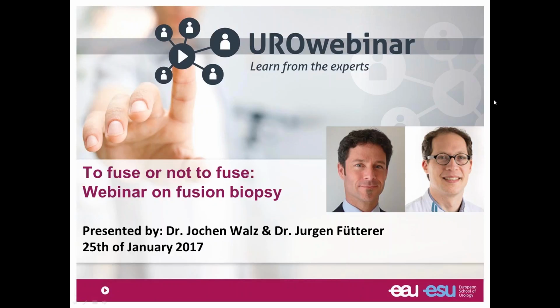There's another question coming up that is addressed to me. Do you defend doing MR fusion biopsy at the first re-biopsy, or would you rather prefer doing it after the second or third prostate biopsy? I think the answer is clear. As soon as you go for a repeat biopsy, this should be an image-guided approach. I was showing you the data. It is really striking. If you compare a targeted with a randomized biopsy in the repeat biopsy setting, you have a higher detection rate. And I think it makes no sense to try a diagnostic test on several occasions when it did not work the first time. So as soon as you had a negative randomized biopsy and you have a strong suspicion that this patient might have prostate cancer, this is where you should switch to high quality MR.